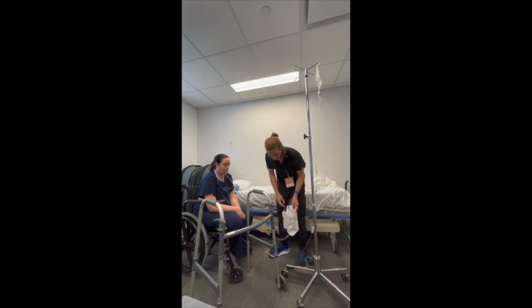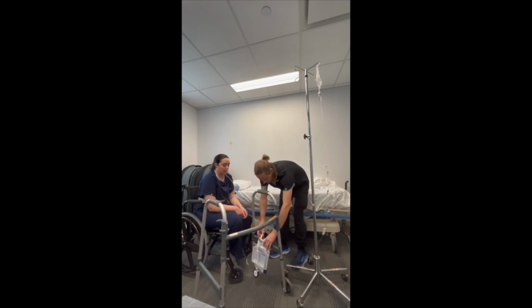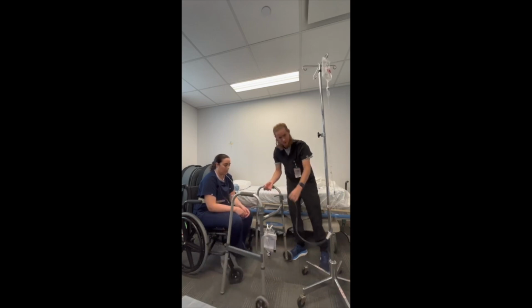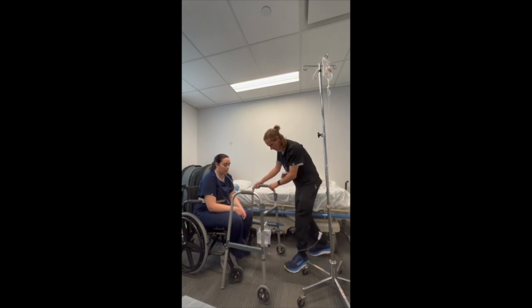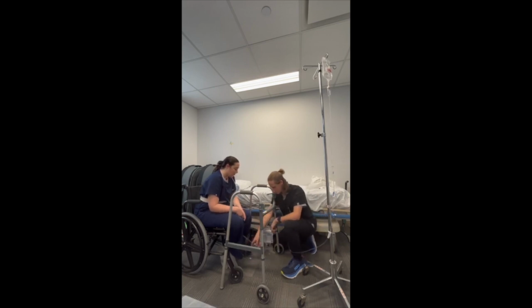So one thing you can do with this Foley catheter here is we're going to bring this in and clip it here on the walker, and then bring the walker in. So we want the IV or anything else running up over it so it doesn't get caught in any of the wires. And as you can see down here right now, we have a little bit of a tripping hazard with the Foley catheter.